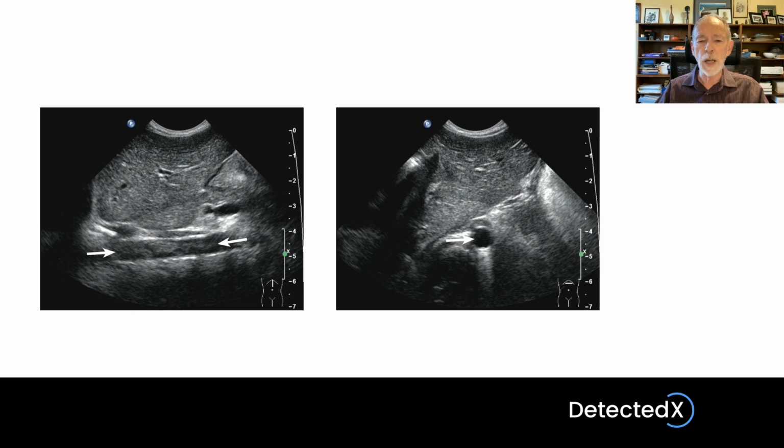So now we are doing a transverse scan of that same blood vessel. In this case, the slice thickness artifact doesn't occur, and we therefore get a clean view of the vessel, and we can see quite clearly there is no thrombus, there are no echoes coming from within the vessel. That was entirely an example of slice thickness artifact.